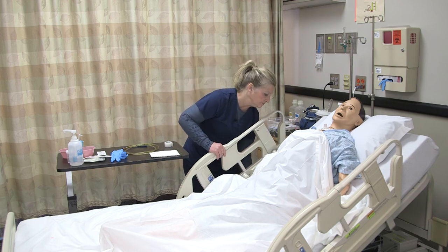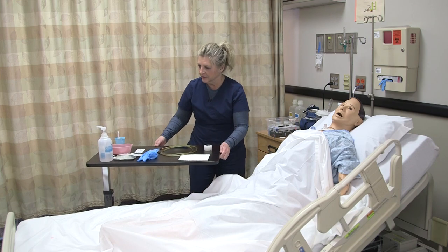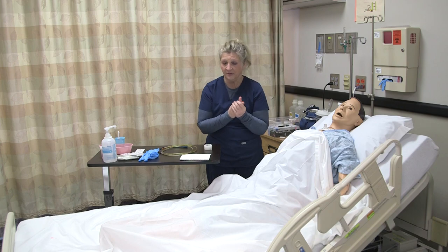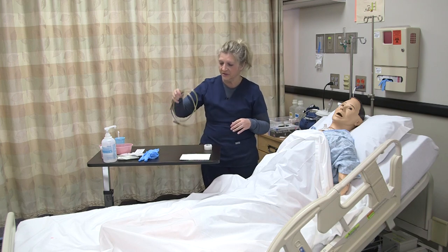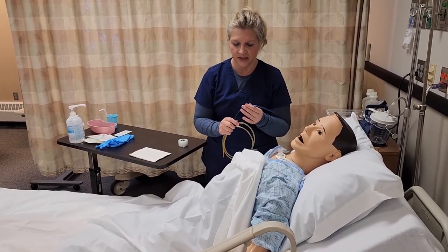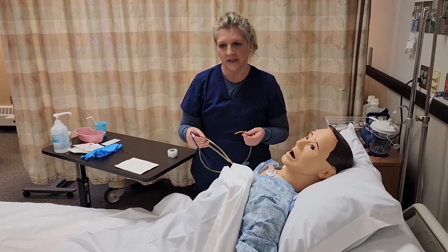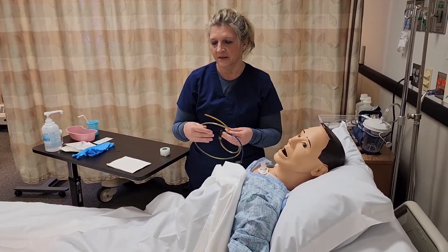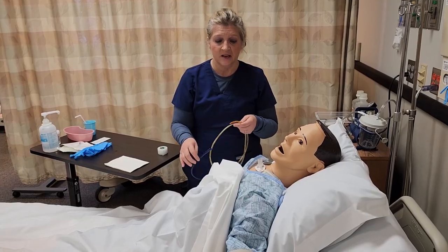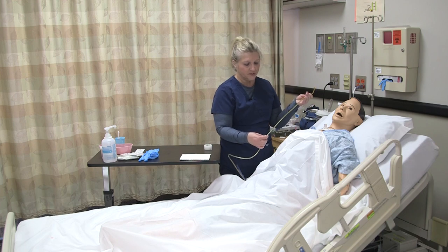I'm going to lower the side rail so I have room to work, move the tray table closer to me, and go ahead and wash my hands again. I need to determine how far I want to introduce the NG tube. This is a sump nasogastric tube — you'll notice it has a blue pigtail on the end. These are used for decompression and can be hooked to suction, but can also be used for administering medications, fluids, or even feeding a patient, just not for long-term use. On this tube there are markings and numbers associated with those markings.